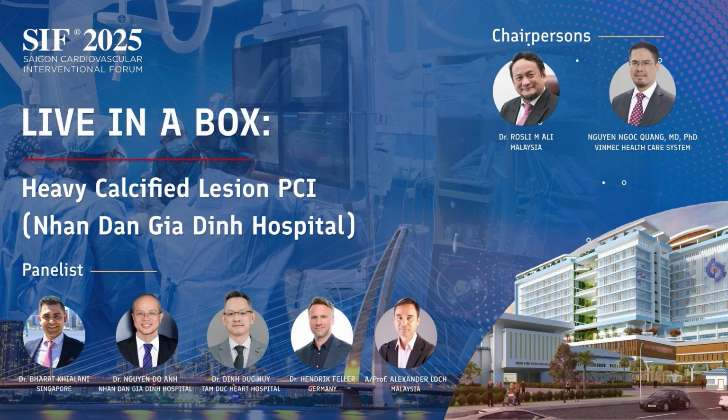Well, of course, it would be ideal to reduce volume, but the data has shown that what you need is good stent expansion. That has been quite consistent. And it's a bit more practical that way, because not many people actually use atherectomy devices. As long as you prepare the vessel very well, and if you have to put in a stent, ensure that the stent is well expanded, and of course there's no stent edge dissection, I think that's fine. I would accept that.